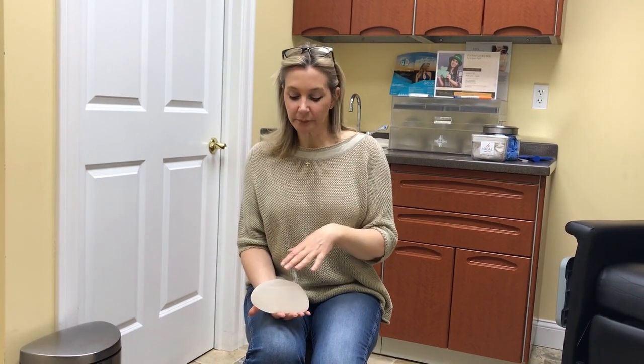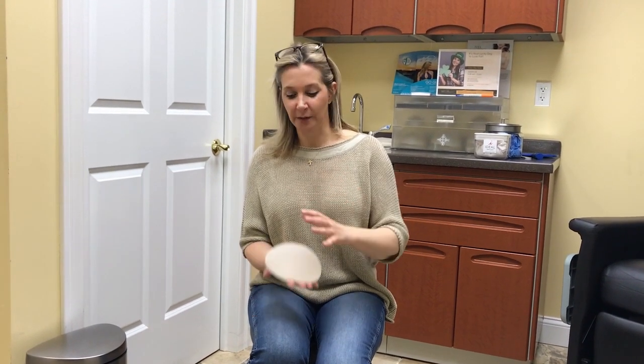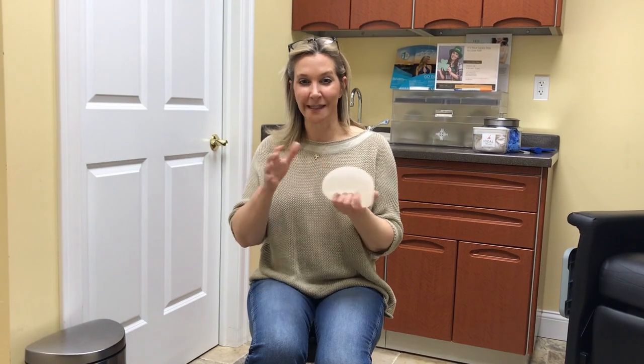In the operating room, some of the things that we do are we give you IV antibiotics through your IV at the time of induction of anesthesia. And I always send people home with a prescription for antibiotics after, because if it is a bacterial contamination, that's going to cut down on the risk of that. Making sure in the operating room that nobody but I touch the implant. That's a no-touch technique. I use a Keller funnel, which makes sure that even the implant doesn't touch your skin as it's going in through the incision.